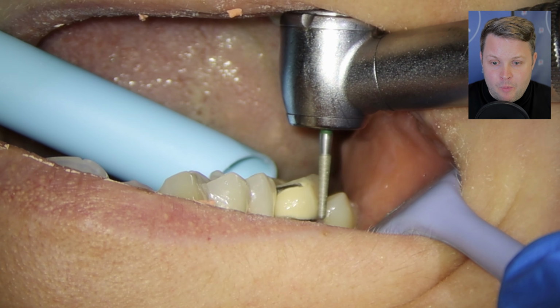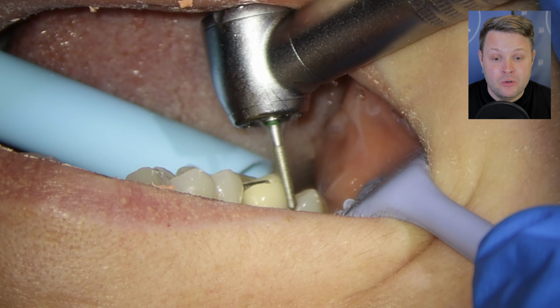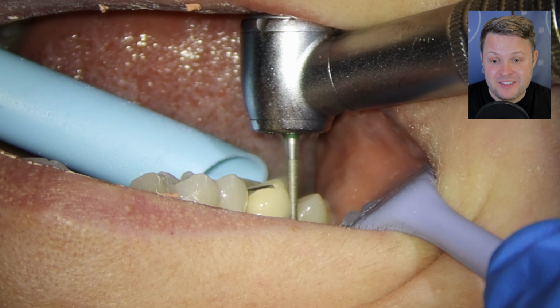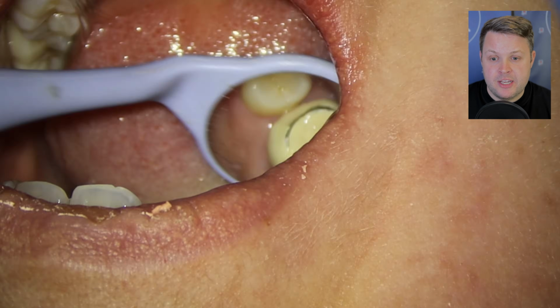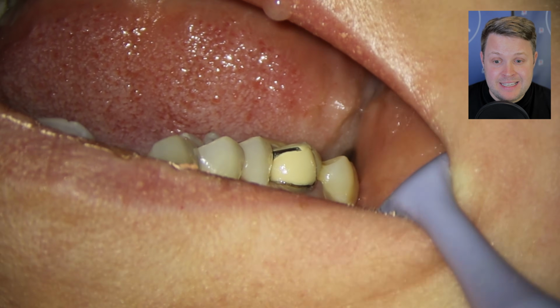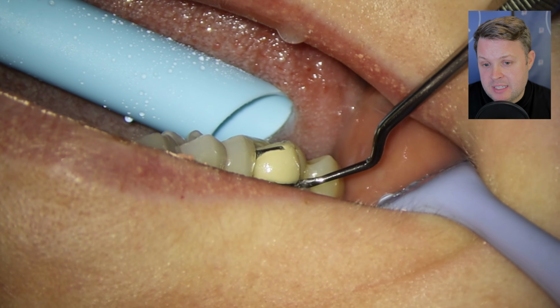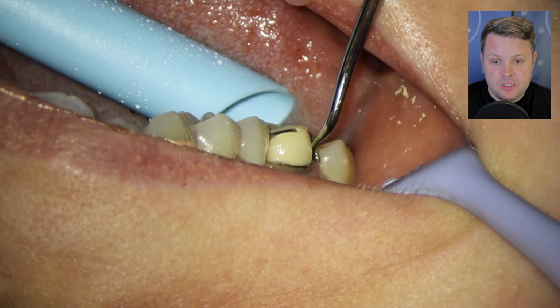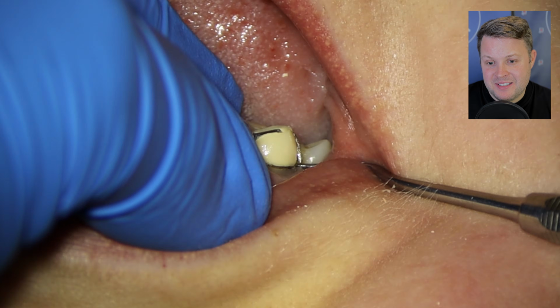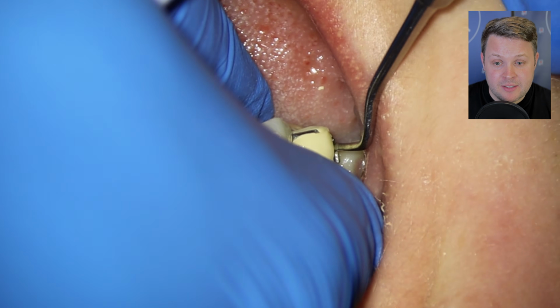And what I like to do when I section a crown, and this might be a bit medieval or whatever, is that I just cut a channel right down the middle of the crown, and then I try and prise away the sections where I've cut down. The problem with this, of course, is that you can damage the underlying tooth tissue. But in my opinion, I just think this is the quickest and easiest way to sort the problem out. I suppose you can use these crown removing implements, and some people swear by them, but in my case, I just like to cut the channel and prise the edges up.